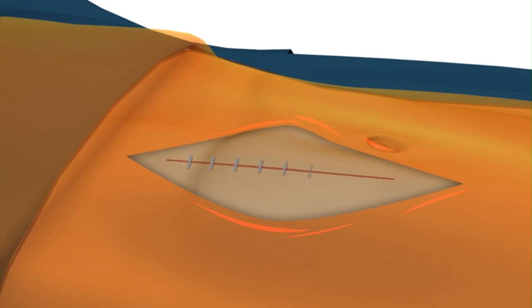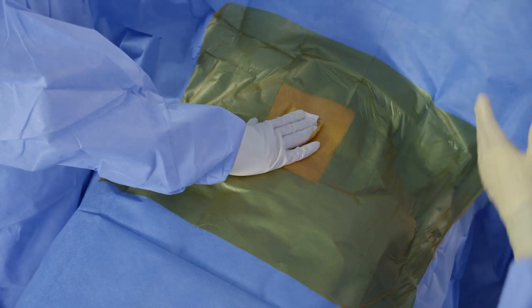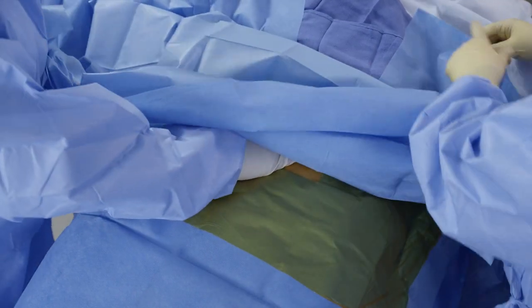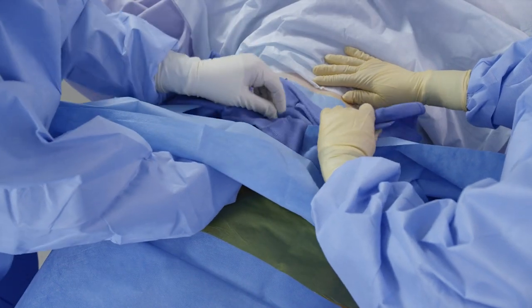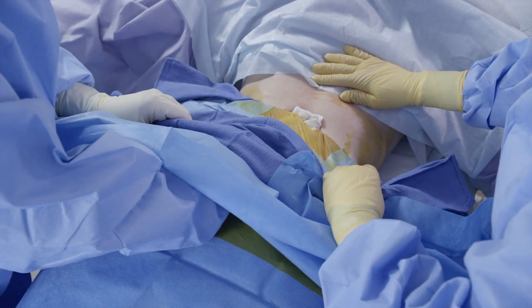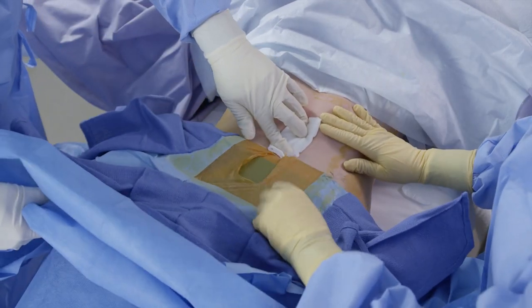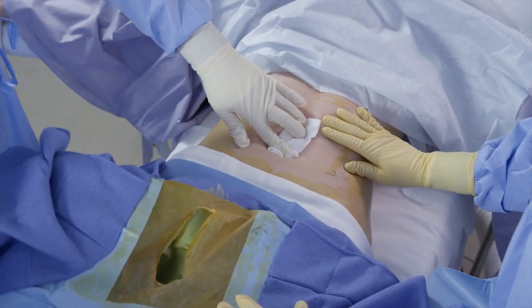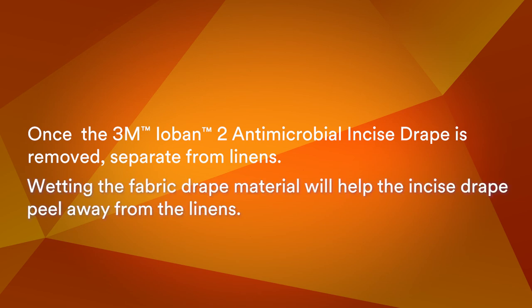After skin closure, cover the incision with the wound dressing. To remove the 3M Ioban II Easy Antimicrobial Incise Drape, fold the drape with attached linen, if used, back on itself at a 180 degree angle. It is critical to go low and slow, pulling gently and with even tension, especially around the incision. Do not pull up on the drape at a 90 degree angle. Once the drape and attached linens are removed from the patient, separate the drape from the reusable linens. Wetting the fabric drape material will help the incise drape peel away from the linens.